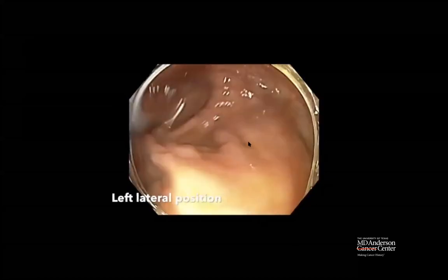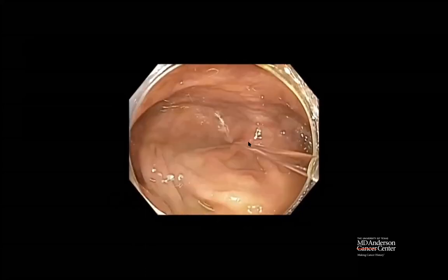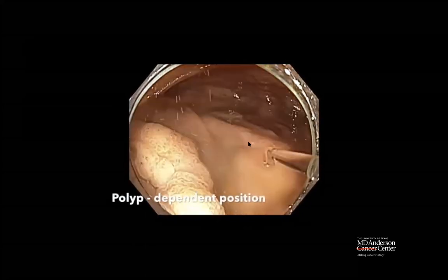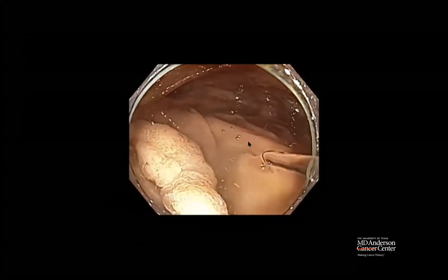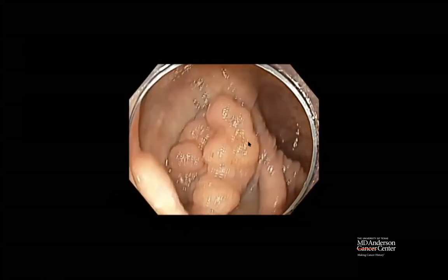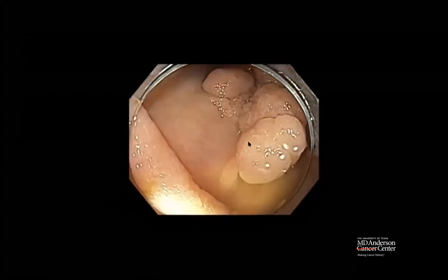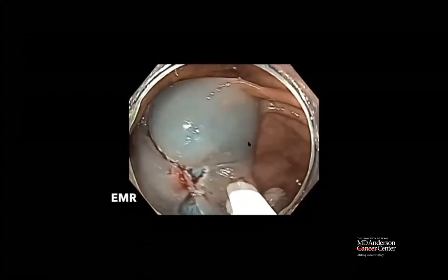Again, another lesion in the cecum, patient in the left lateral position. The polyp is in the dependent position, as you can see. Then I rotated the patient from left lateral to supine position, and the polyp became non-dependent, as you can see here. It is not submerged.